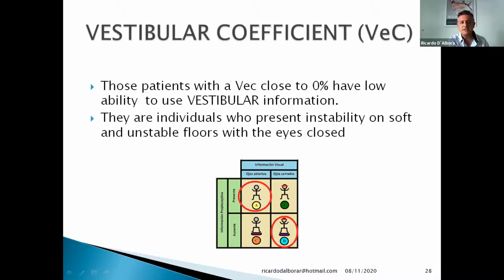Vestibular coefficients: those patients with a vestibular coefficient close to 0% have low ability to use vestibular information. They are individuals who present instability on soft and unstable floor with the eyes closed.